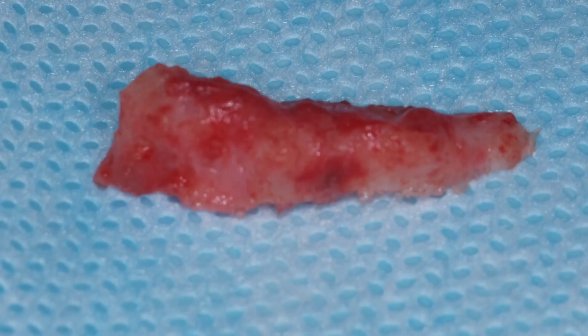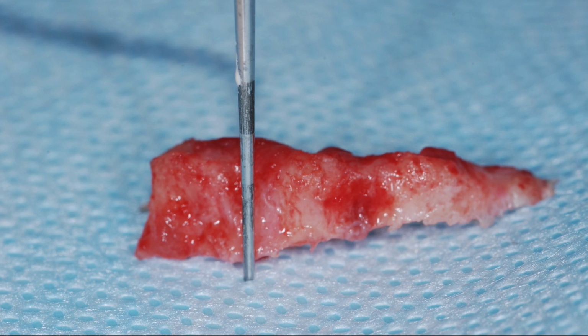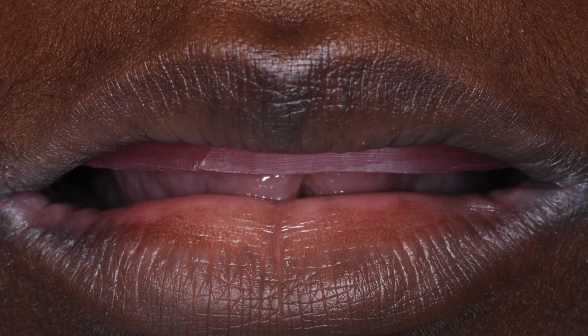Set her anterior mandible on the table there. About 8-9 millimeters, so that I can fit the prosthetics to her face and give her teeth that are not compromising the vertical and fit her face so that she can rejoin society.